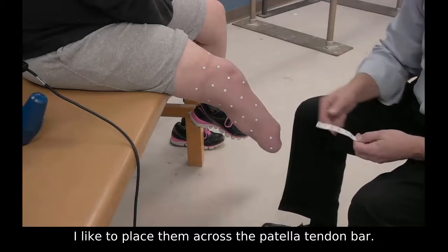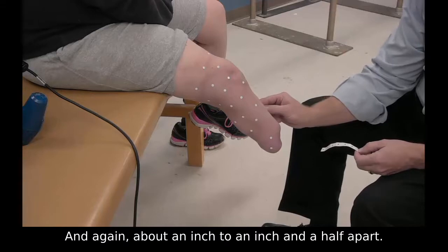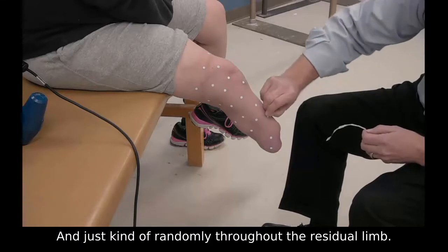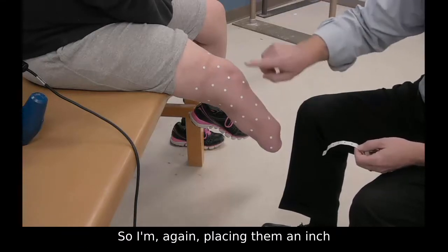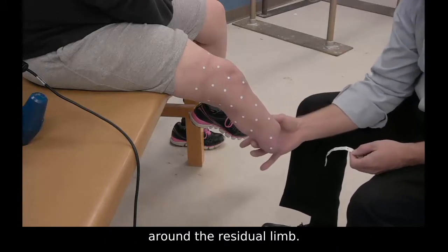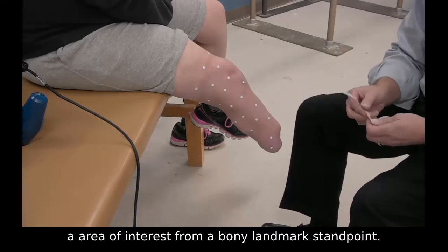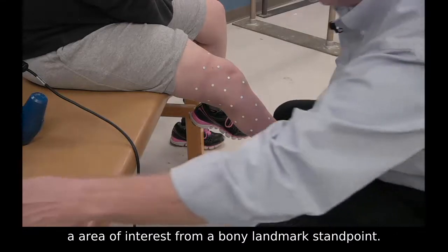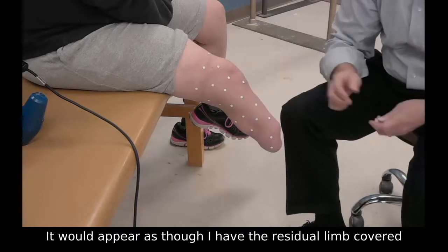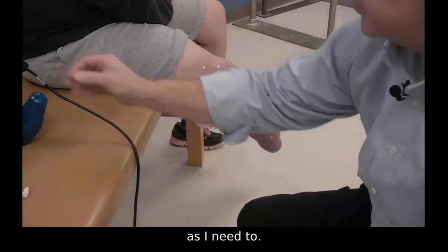I like to place them across the patella tendon bar, and again about 1 inch to 1.5 inches apart, and just kind of randomly throughout the residual limb. So I'm again placing them 1 inch to 1.5 inches throughout and all the way around the residual limb. And again, anywhere else that there's an area of interest from a bony landmark standpoint. It would appear as though I have the residual limb covered as I need to.